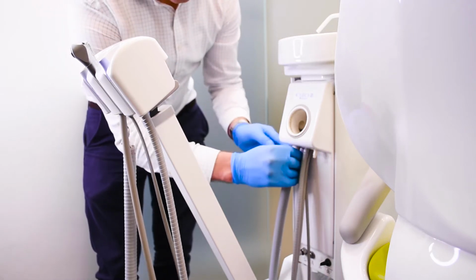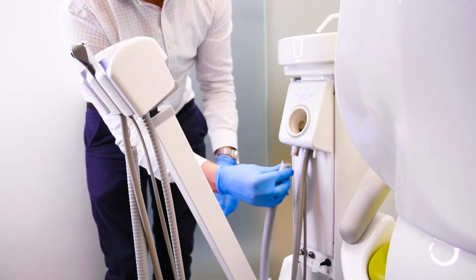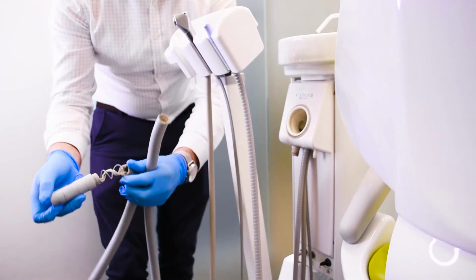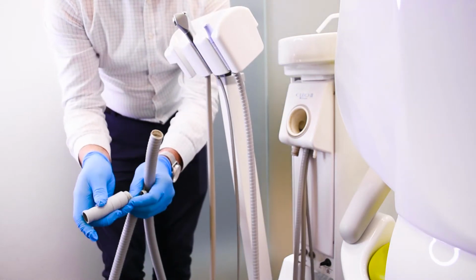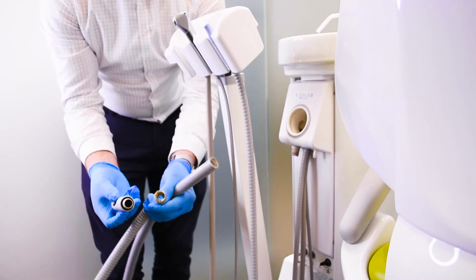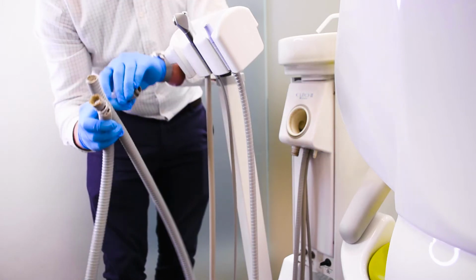So to do that, you twist and pull, and the hose detaches from this connector here. It'll also disconnect from the suction tip valve. This one here is damaged. So you pull it and it comes off. It can be difficult, but it will disconnect from the bottom of the tip valve. The old hose can then be discarded.